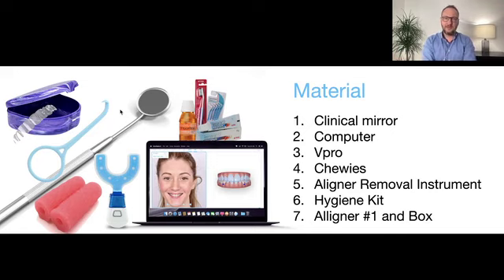But in my experience, the best outcomes, and the way to keep patients motivated, come when I use the first appointment to first deliver aligner number one. Here it is, the material. I open the software and show the patient all the details. I review, because sometimes we present the treatment planning and what we want to do, they approve, they pay, and then we order aligners. Depending on where you are, it can take more or less time for the aligners to come, maybe 15 or 20 days. Then we are here with the patient again to start, so I like to review the most important details.